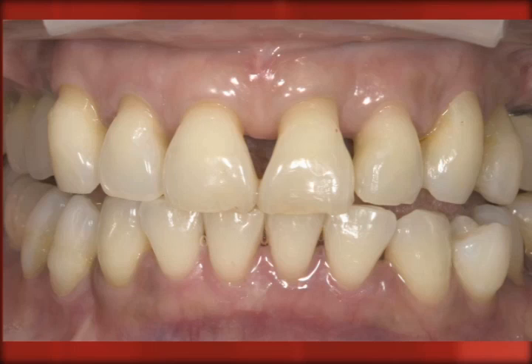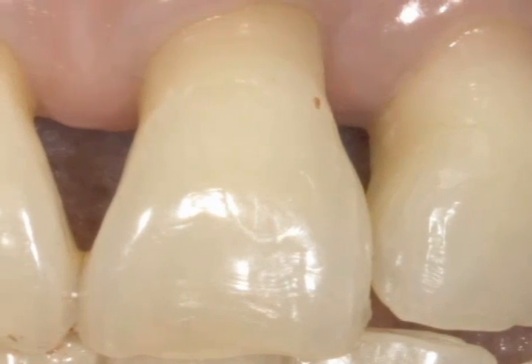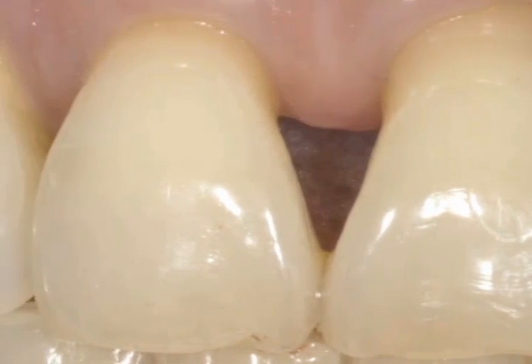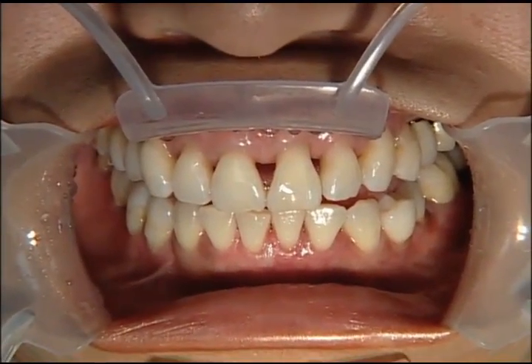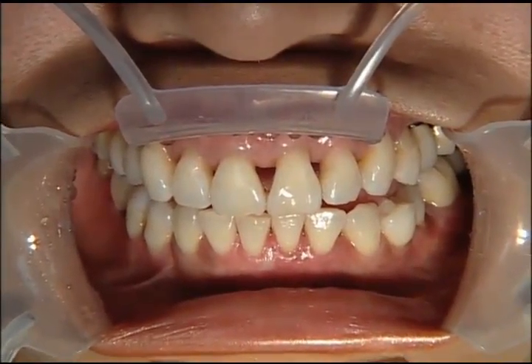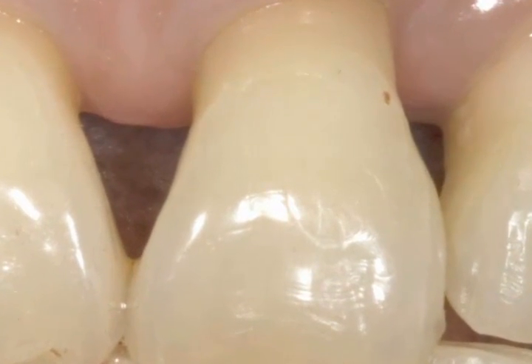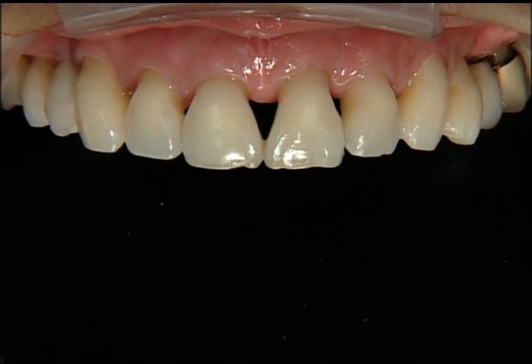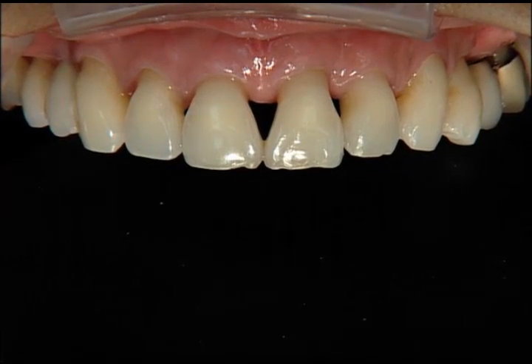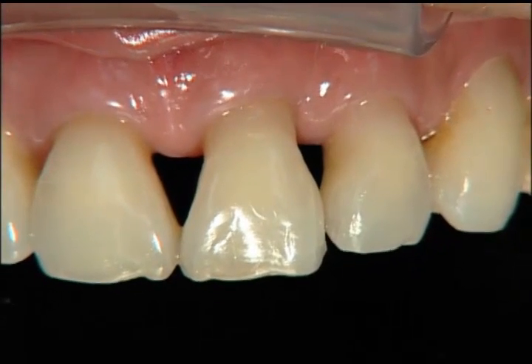In this case, you're going to see we have an interesting situation — some huge open gingival embrasures. These are post-periodontal surgery, and the patient's tissue is now very healthy, as well as the pocket depths. But we have these huge open gingival embrasures between teeth 8, 9, and 10. As we zoom in, you can see just how large these embrasures are. The patient reports getting food caught in here when she eats, and she doesn't like to smile anymore. When her teeth are together and she smiles, you can see her tongue through it as well.